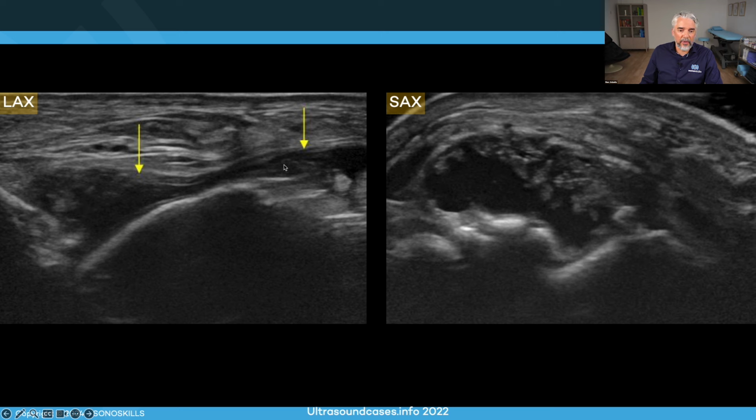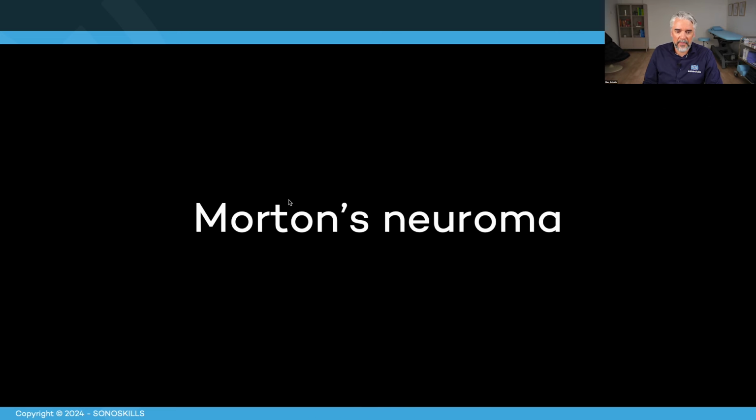Synovitis: we can see a strong effusion right here with the capsule being pushed up, and we can see capsular thickening, synovial proliferation, and lots of anechoic effusion.